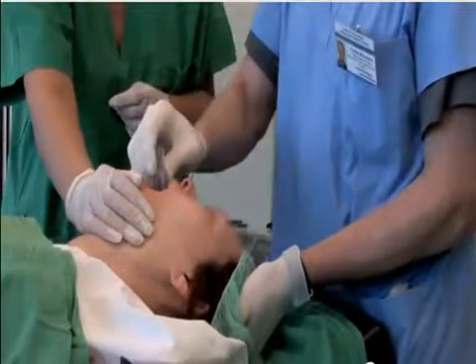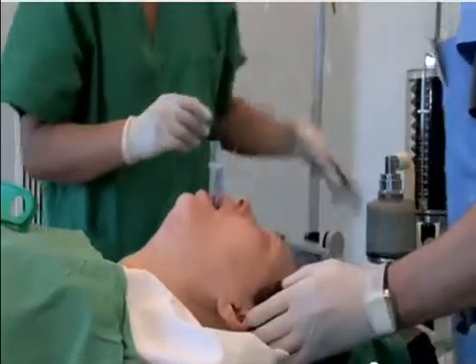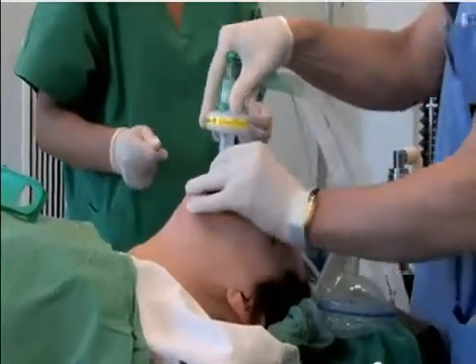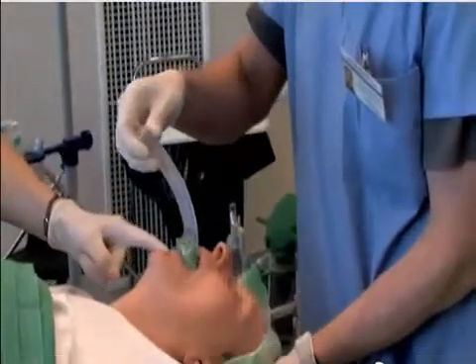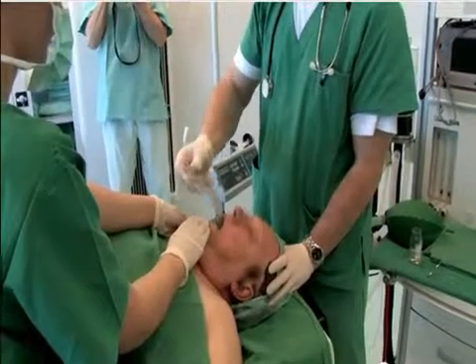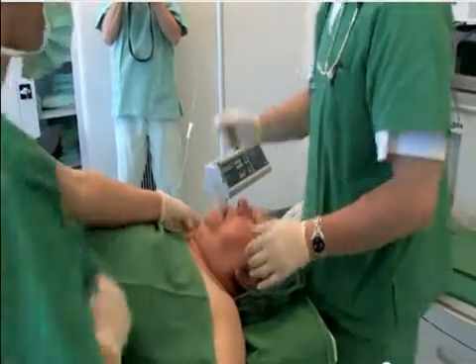Note the sniffing the morning air position and the gentle press down on the chin. See how there is no need for fingers to be inserted in the mouth. There is never a need to apply excessive force or to repeatedly push down on the device once definitive resistance has been felt.